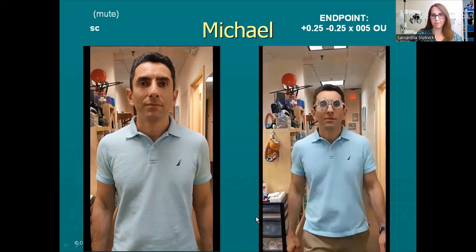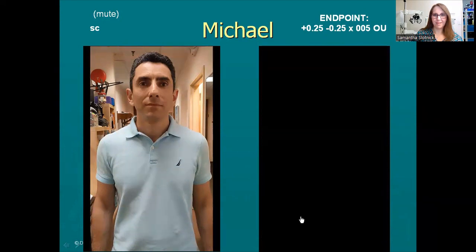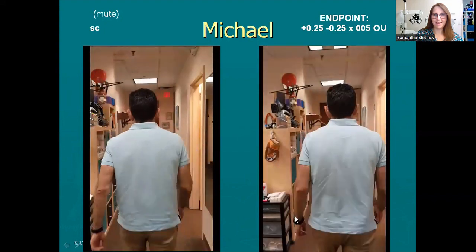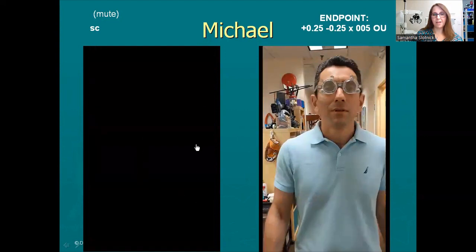Yeah, it's lighter, steadier, and I feel a little different. I feel lighter. Yeah, you're walking also with more integration between the two sides. So you should be able to see him side by side. There's just greater ease on this side. And on the left side, you could see maybe there was a little bit of loping as he would come towards forward. You'd see him kind of bow to the left side a bit. So that was his baseline. And this is where we ended up.